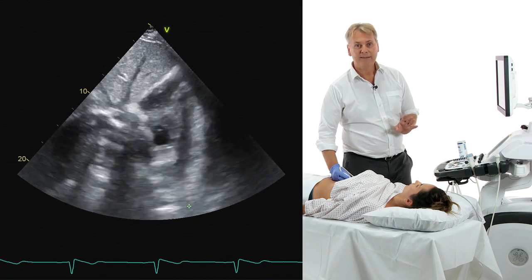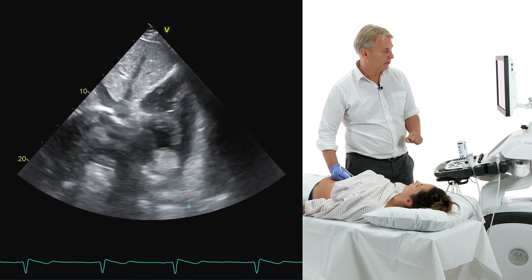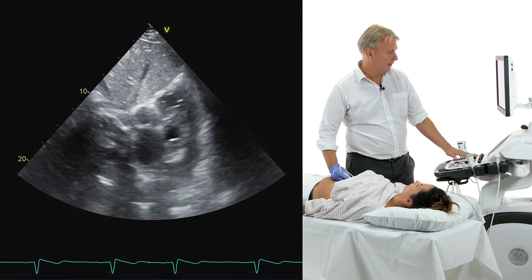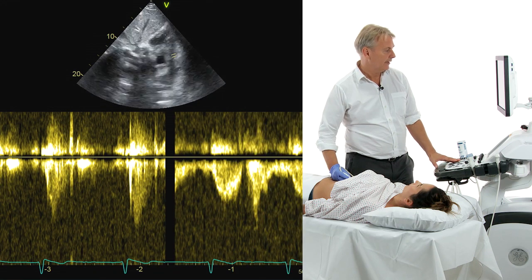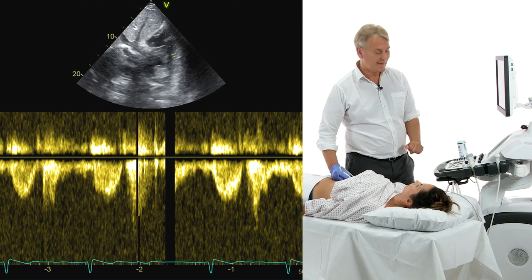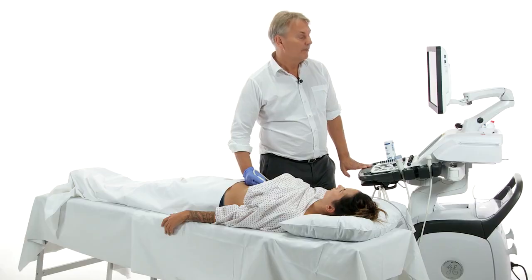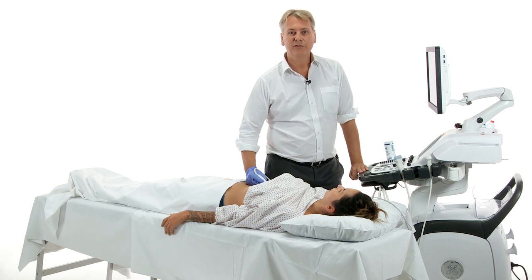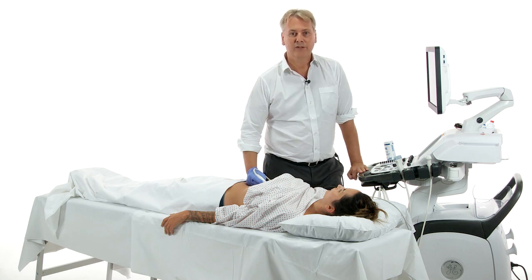This, as a matter of fact, is my favorite view if I really want to assess the flow signal across the pulmonic artery. You see how nicely this can be performed? You put the transducer right here, and you will often get a fantastic image quality of the pulmonic artery. So be creative when you use the subcostal view, and also use the short axis views to demonstrate the entire heart, just from a subcostal window.